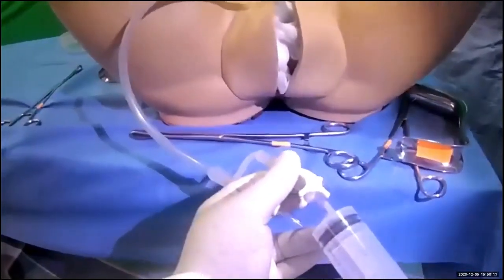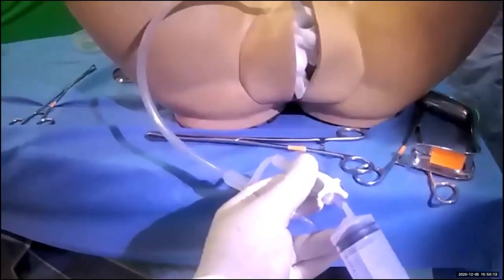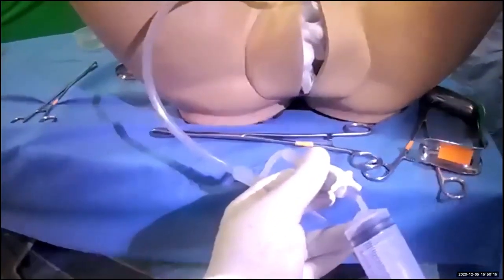Ladies and gentlemen, that is how you insert and use a uterine balloon tamponade.